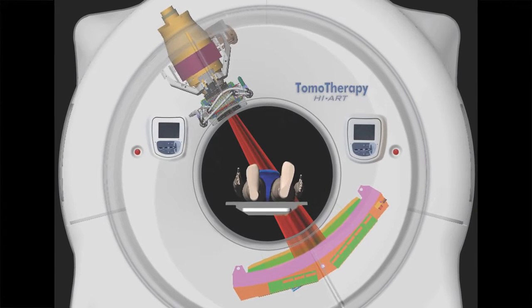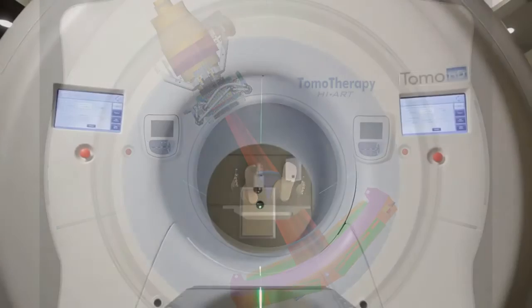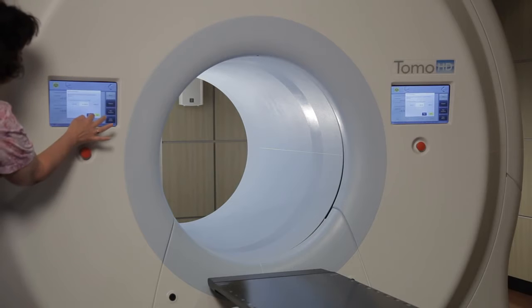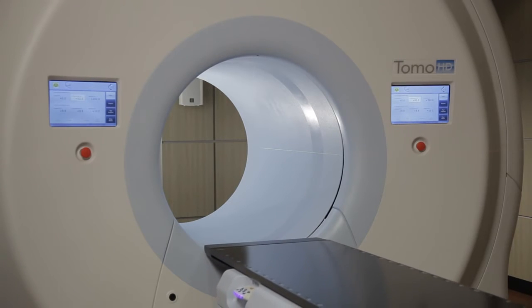With TomoTherapy, the radiation comes all around, and so it distributes everything. And it turns out when you distribute things like that, you get much better dose distributions. In a sense, what you can do is you can minimize a lot of the dose to the healthy tissue a lot better because of that kind of radiation treatment.